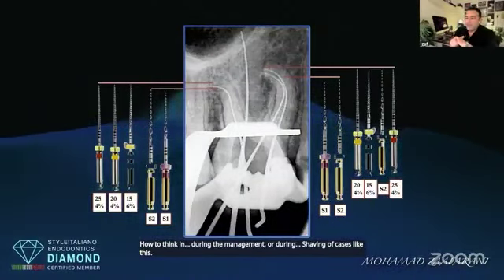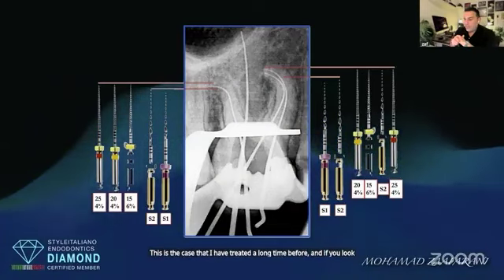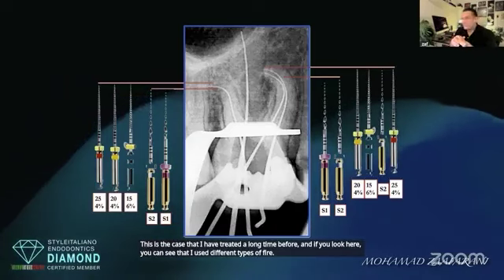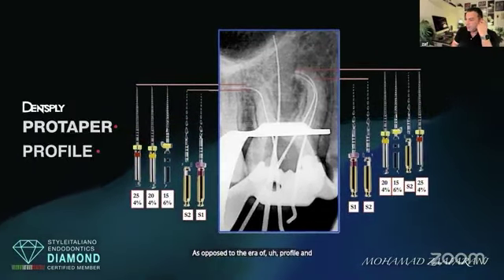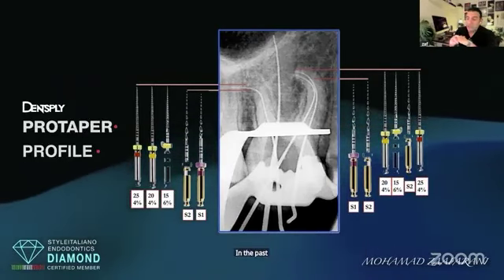This is a case that I treated a long time ago, and if you look here, you can see that I used different types of files. That was in the era of ProFile and ProTaper from Dentsply. So in the past I usually started my treatment using ProTaper.